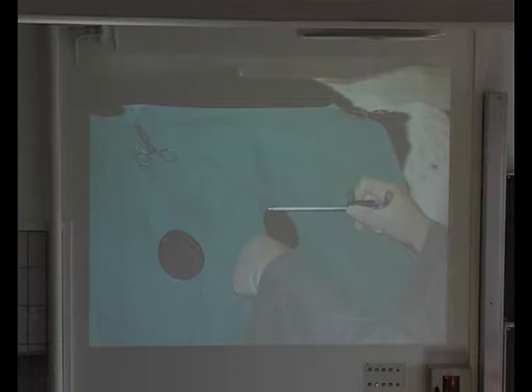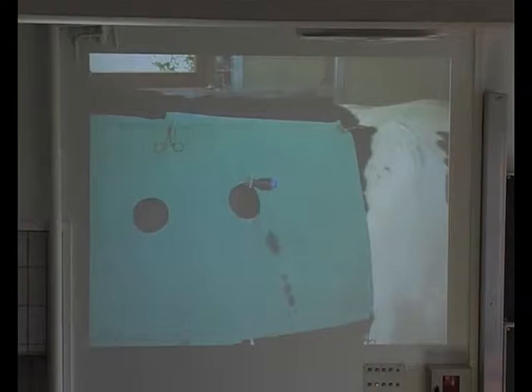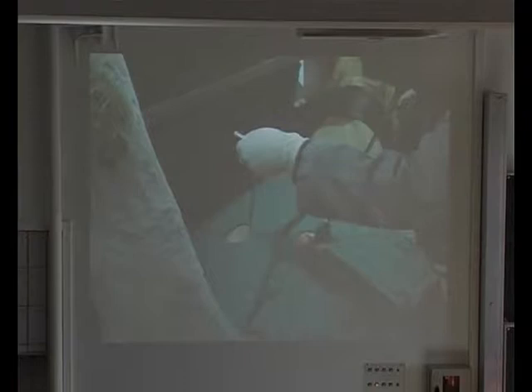So, the procedure. If we have a not displaced or right displaced abomasum, we start in a similar way. First, we create a pneumoperitoneum on the left side. We do not create it on the right side, we do it on the left side too. We bring in air, and it's better to bring in not only passive air inflow, so we can insufflate a little bit of air, and then we lay down the cow in dorsal recumbency. We do this with our operation trailer. And now we have to decide the position of the abomasum. So we start with this first case.